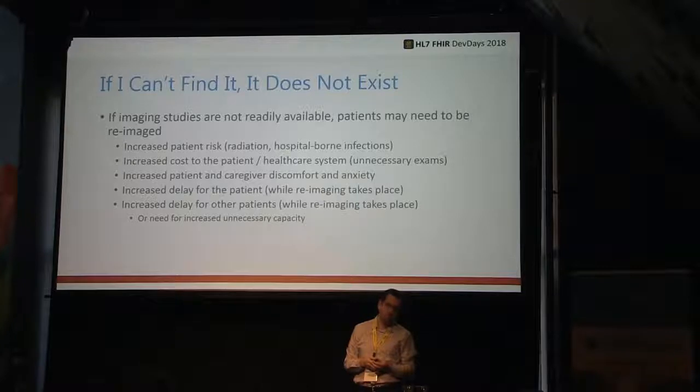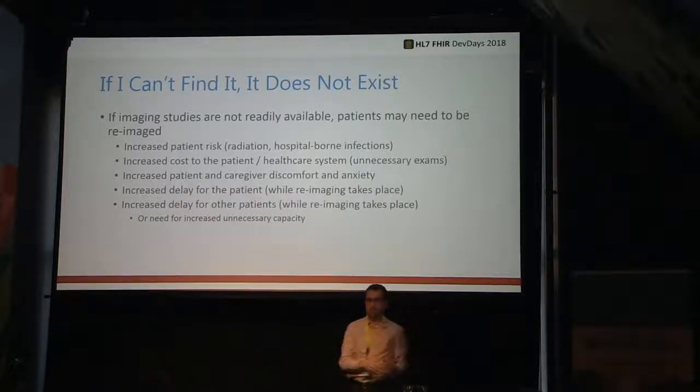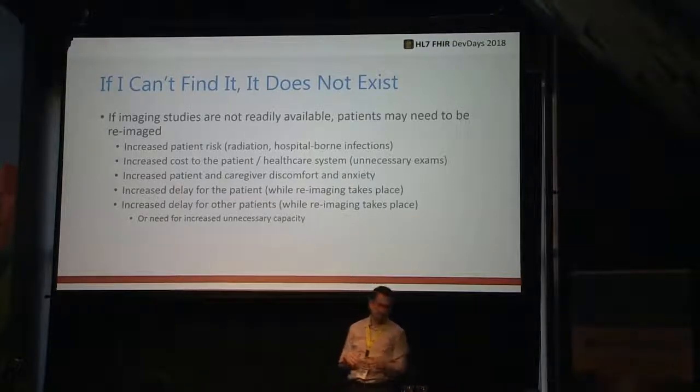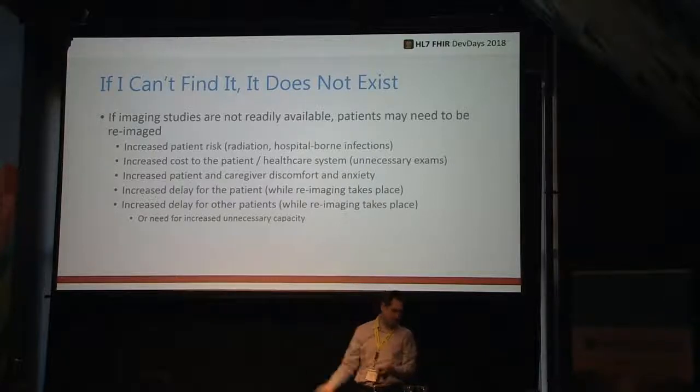Of course, the other problem that's a common problem with imaging, even though we're in 2018 now, is sharing images. So, you did imaging at one facility, and then a year later you go to another facility, they don't have your images. Now you have to be re-examined, it wastes time, it wastes resources.